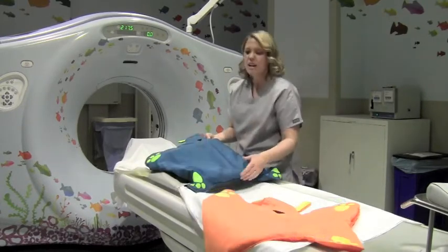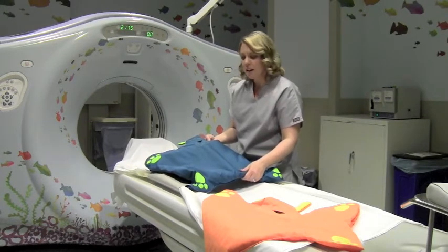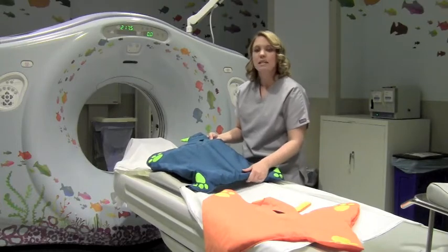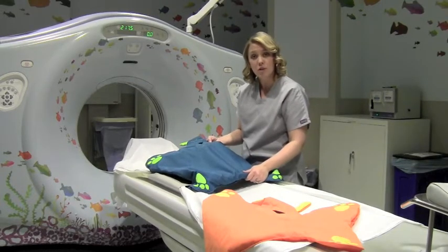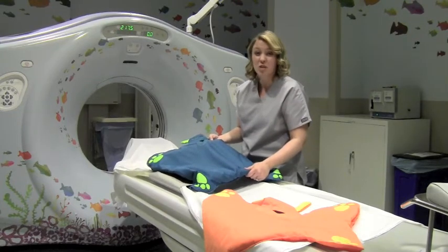Instead of having a cold gray strap that might be causing some anxiety, by having a choice between the kitty or the doggy, it also makes it feel like it's the child's choice to have a strap on, instead of having it seem like a barrier or a restrictor.